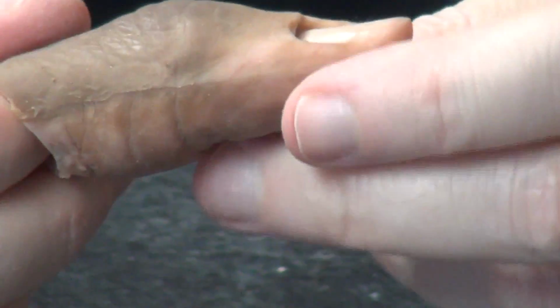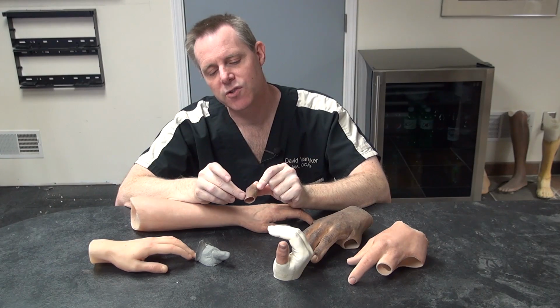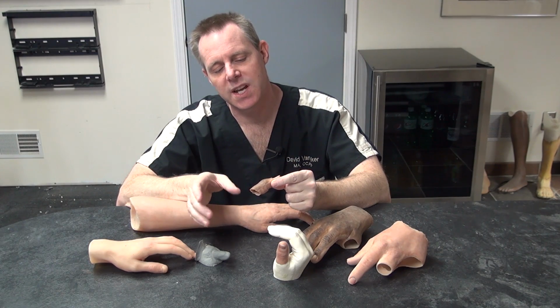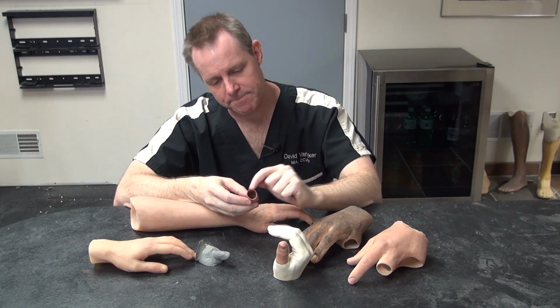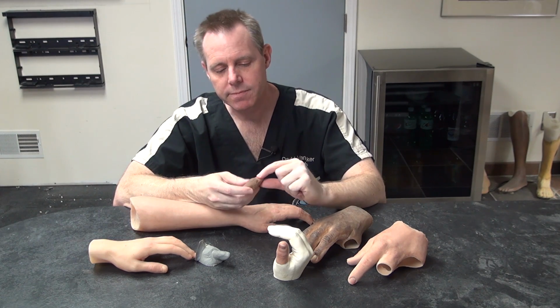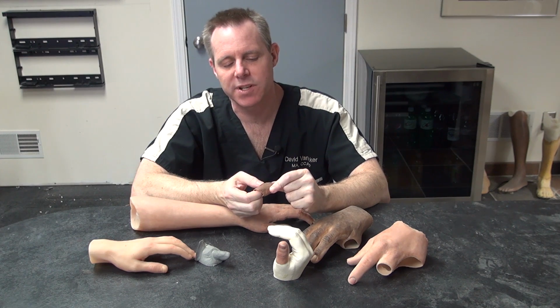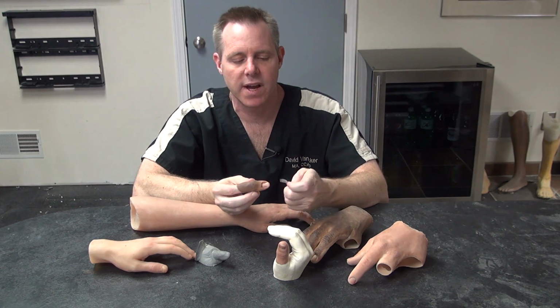By not having to paint on the prosthesis, you maintain a better surface texture. You know, because when you use a life cast, it has all these nice human textures. And what we're trying to do then is to recreate those textures as accurately as possible and not fill them in with all kinds of paint.